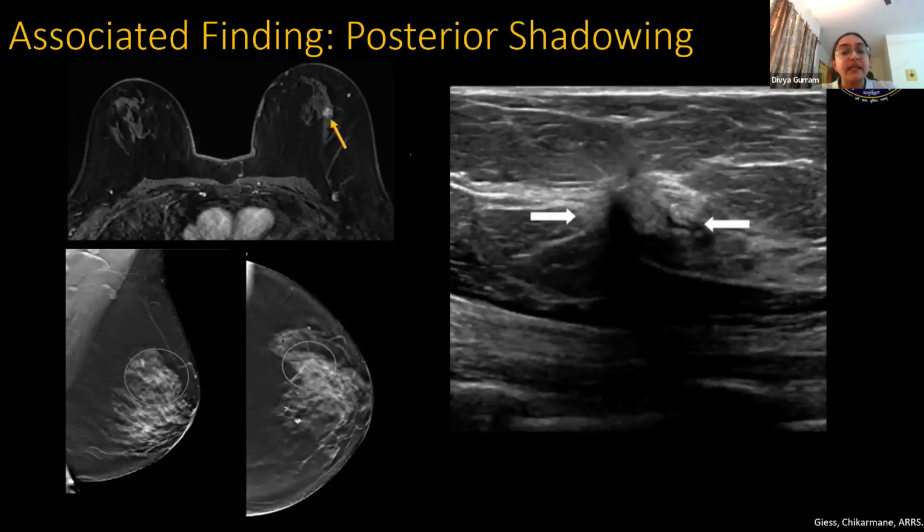This was another screening MRI, which was done for a high-risk patient. On her left breast, we can see that there is this focal area of heterogeneous non-mass enhancement with a correlate of architectural distortion seen on mammography in her right breast. On ultrasound, this lesion was found to be an irregular mixed hypoechoic area showing dense posterior acoustic shadowing that is almost like foretelling that this could be a malignant etiology. This turned out to be ductal carcinoma in situ.